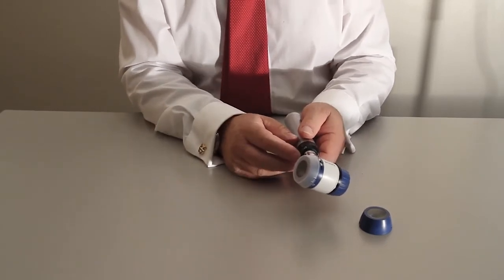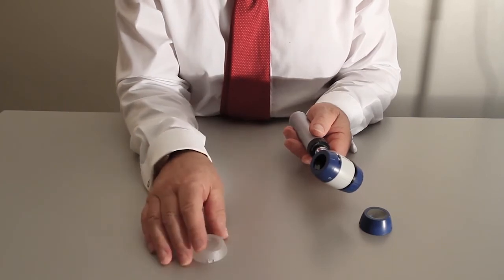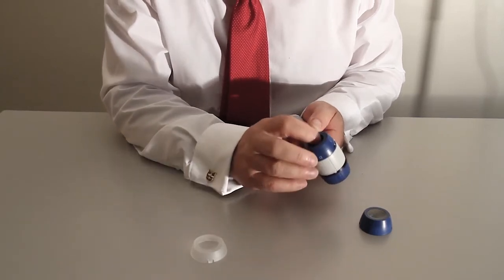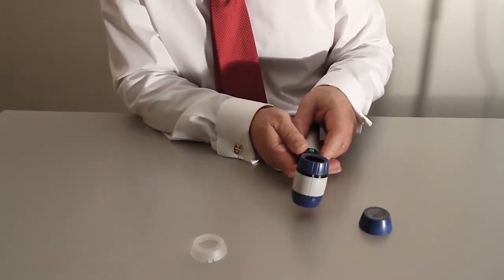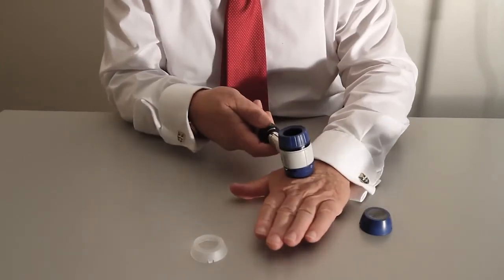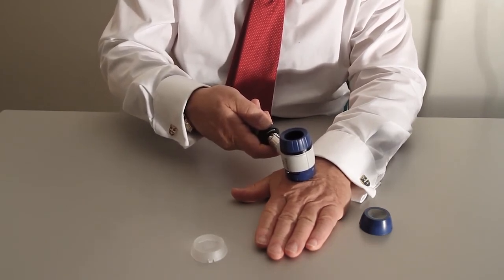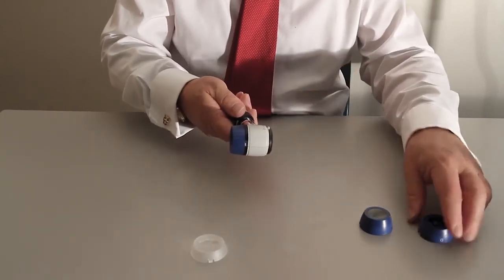The other really useful feature of this is that if you take this disposable lens cover off, you now have a gap there in front of the lens. You can see if I put a finger in there, the lens itself is actually down towards the base. Now if you want to look at a vascular lesion or a very soft wobbly lesion, you can put this onto the skin, with the lesion in the center of that hole, and you're not putting any pressure on it, so you're not going to squeeze out the blood vessels. So that's a really clever additional resource for the Opticlar.